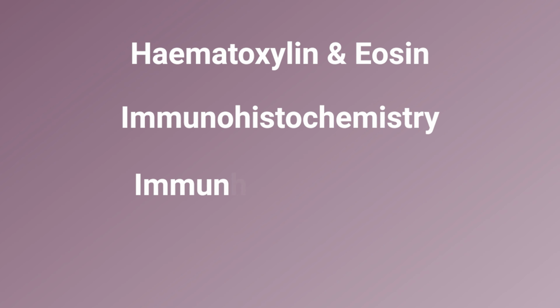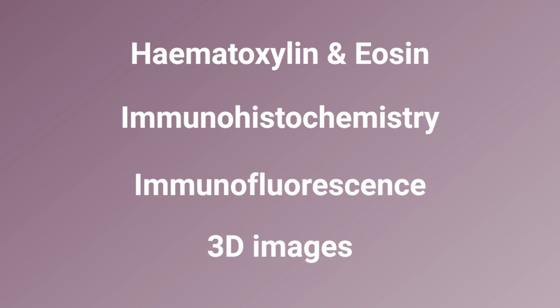And number 8 is PathML. This one is a toolkit that helps prepare images from different formats and different imaging modalities for image analysis workflows. And it provides a general framework for creating and running pre-processing pipelines on different image formats. The PathML library is written in Python, and it supports different imaging modalities like hematoxylin and eosin, immunohistochemistry, immunofluorescence, and even 3D images. It works with all the different whole slide image formats. Over 160 formats are supported, and obviously it has whole slide image analysis capabilities.